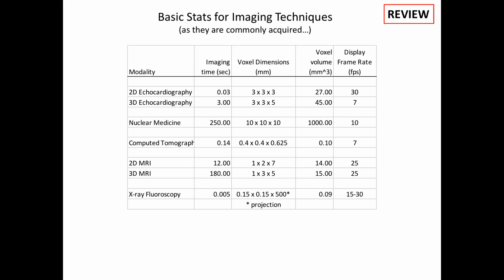The voxel volumes are moderate in terms of spatial resolution. You can make high resolution ultrasound, as we'll see, if you have the transducer really close to something, like say a vertebral artery, you can place a transducer right on the artery. And so the stuff you're imaging is millimeters below the transducer, and you can make higher resolution pictures if you're close to the transducer. As you go to depths inside a whole patient, like inside the chest or in the liver, at those depths, these are the voxel dimensions that are typical, right? It's 3 millimeters by 3 millimeters.